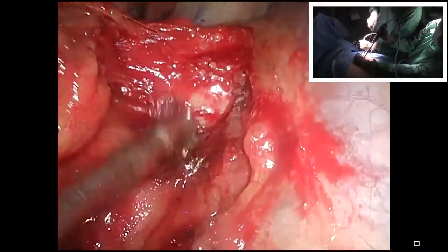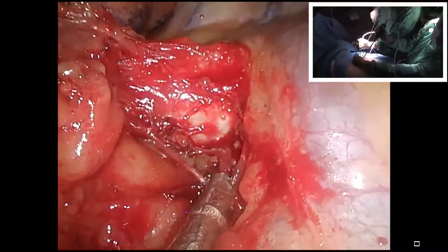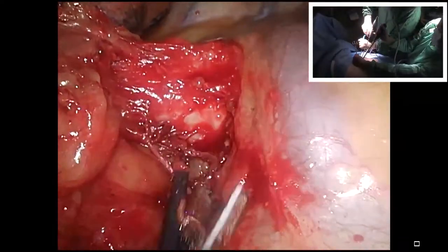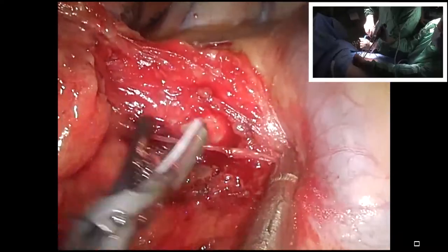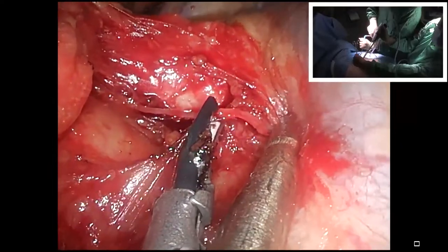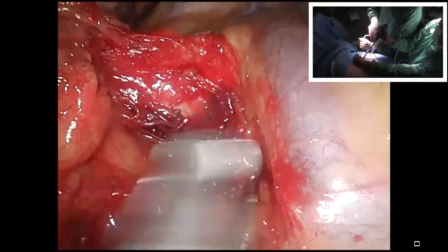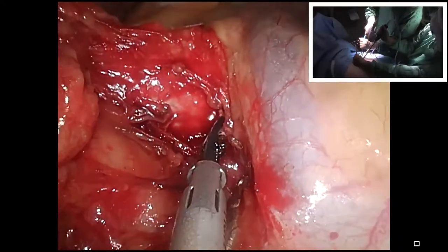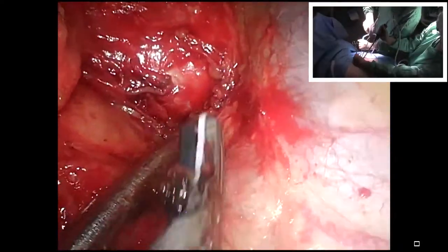You know, it is very good also in the normal upper lobectomy, just to prepare these lymph nodes before cutting the artery. So this is what Diego is trying to do now, in order to keep. We understand.